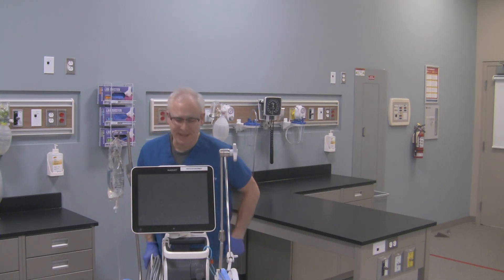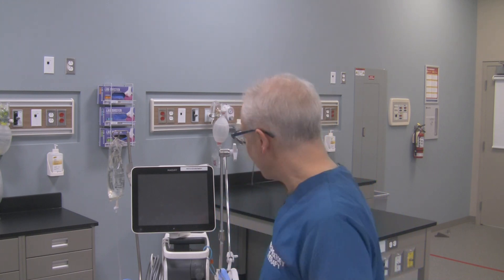Hi, George here. Hope it didn't scare you. Anyways, what I want to do in this video is just simply go over some of the features of the Servo U ventilator, in case you don't have one in your unit or you're getting one soon. You're just going to see what's different between it and the Servo I, or maybe you're just getting a Servo for the first time in general. Anyways, let's take a look at this ventilator.